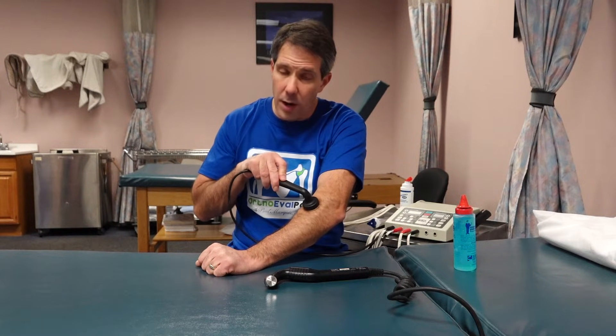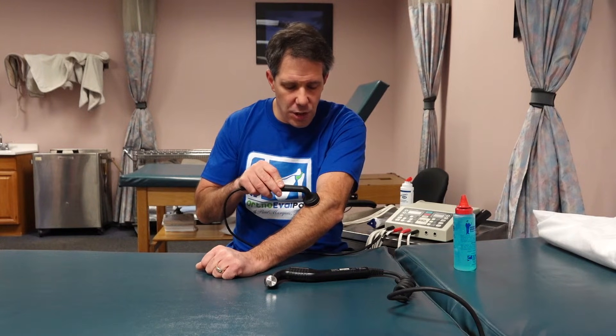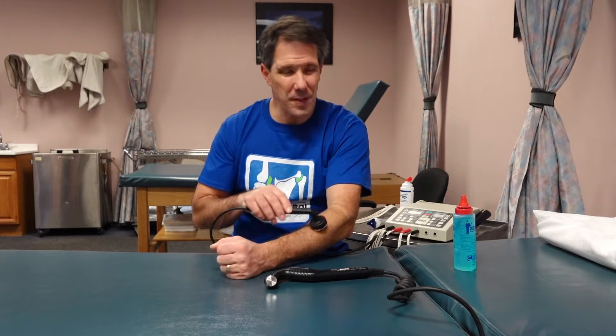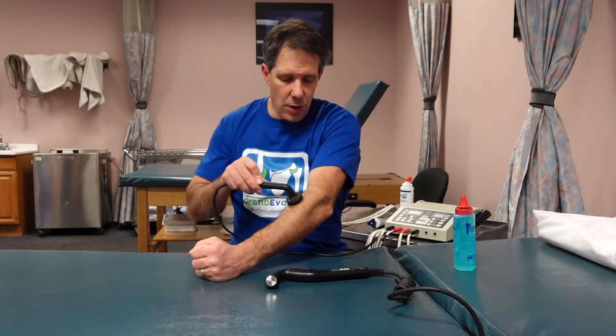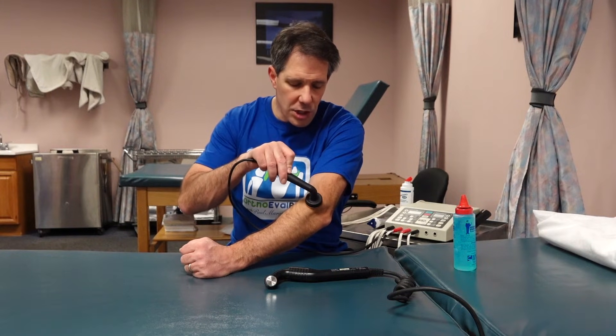Technique is important. You should not keep your ultrasound in one spot if you're doing thermal ultrasound, because concentrating the sound wave in one place will really hurt the patient — like a rope rubbing on your hand in one spot causing a burning effect. You won't physically burn the patient, but they'll feel a very uncomfortable sensation. Maintain a constant little circular motion in that area, going no further than twice the size of the sound head. If they can't tolerate the discomfort, turn it down a little. For pulsed ultrasound, you can go a little slower to focus on the area.